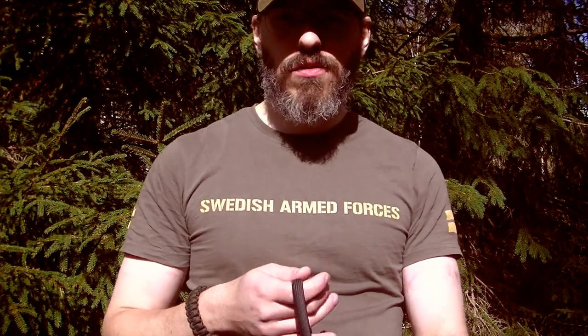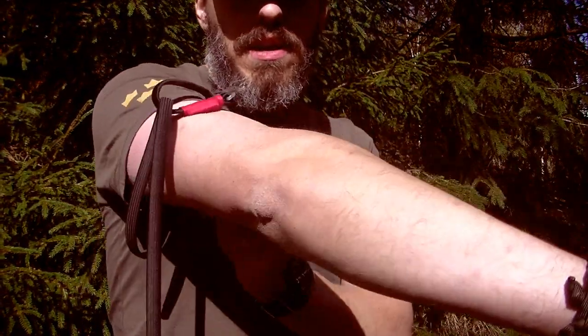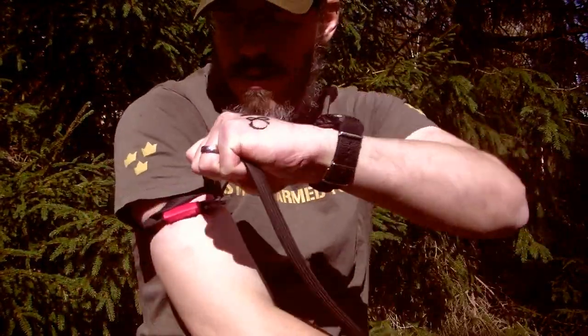Welcome to another episode of The Shorts. This is a follow-up on the video about using or carrying a tourniquet as a civilian. You saw me checking my radial pulse when wearing one of these rapid application tourniquet systems — the RATS tourniquet.